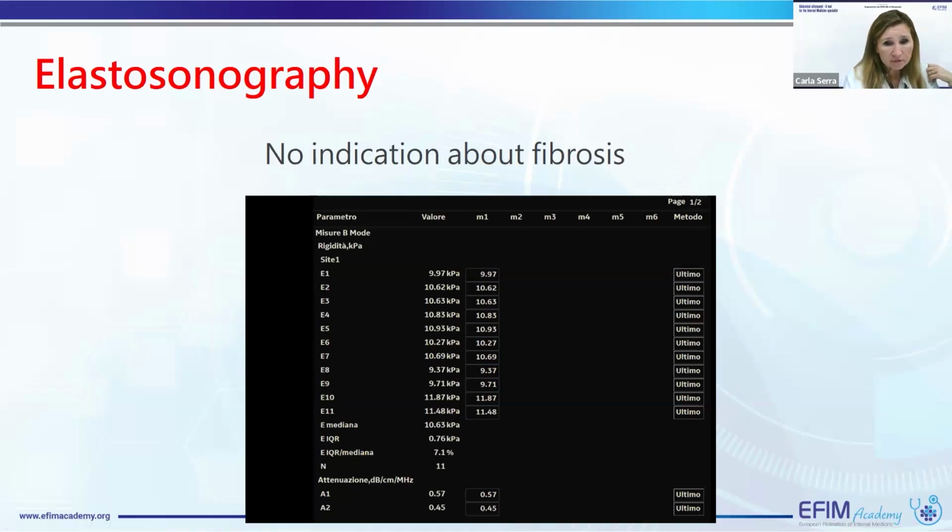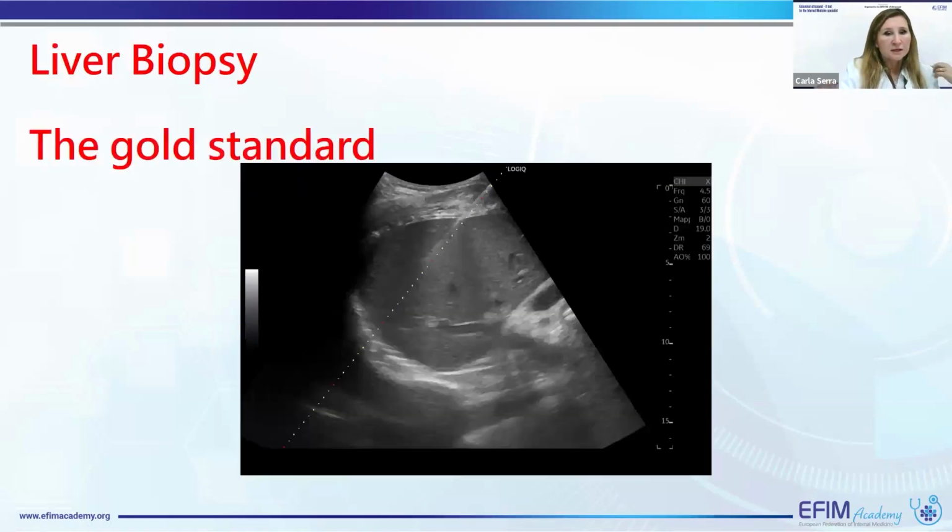So the stiffness of the liver increased, but it is not due to fibrosis, but to congestion.